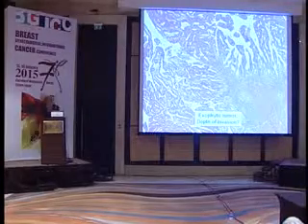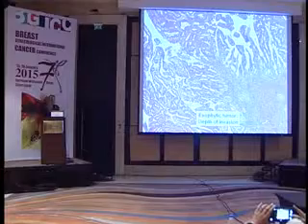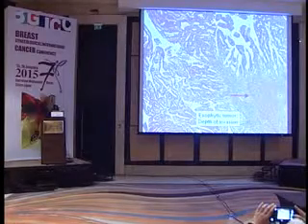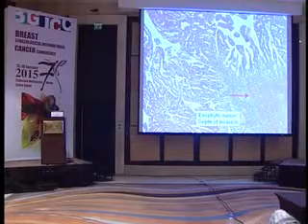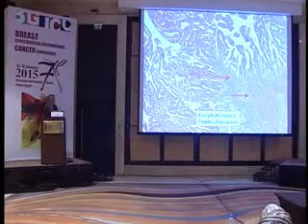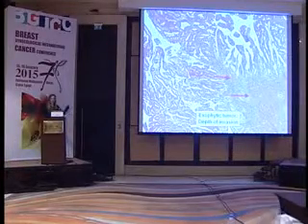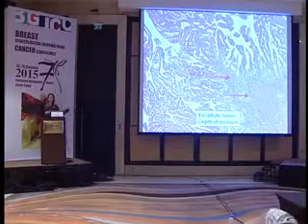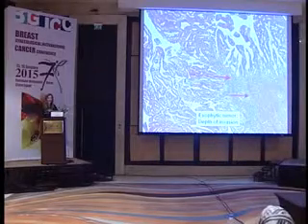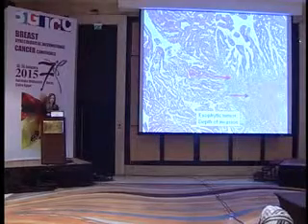And again, back to that previous image I put, in the exophytic, is it from here to here? God, it's a huge lesion. Someone might argue with me from here to here, or even from here to here. So we do our best, and we show the cases. This is why it's confusing. And it's confusing to me, believe me. And this is why I put it here. It's not easy, and if you cannot do it, do tumor thickness. Okay?